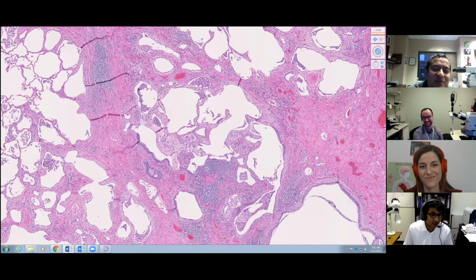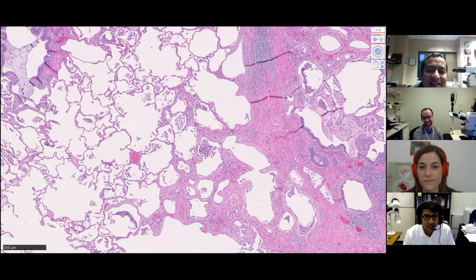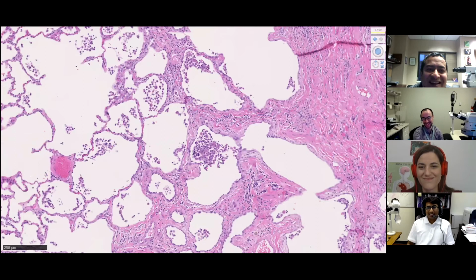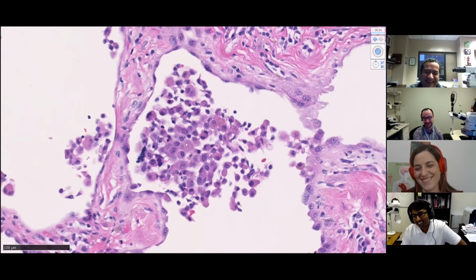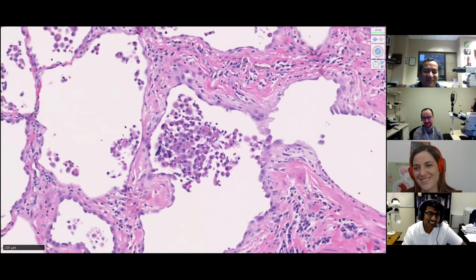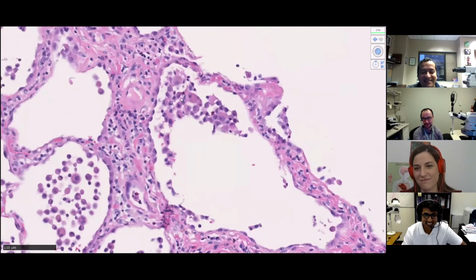So Raghav, can you just bring it back to those smokers' macrophages for one second? Matt, do you like that for DIP now? The airspaces are full of macrophages, and there's a lot, right? No. I wouldn't call this DIP. I would just say there's lightly pigmented alveolar macrophages, because I think there's a UIP going on here, and this is a risk factor for UIP.